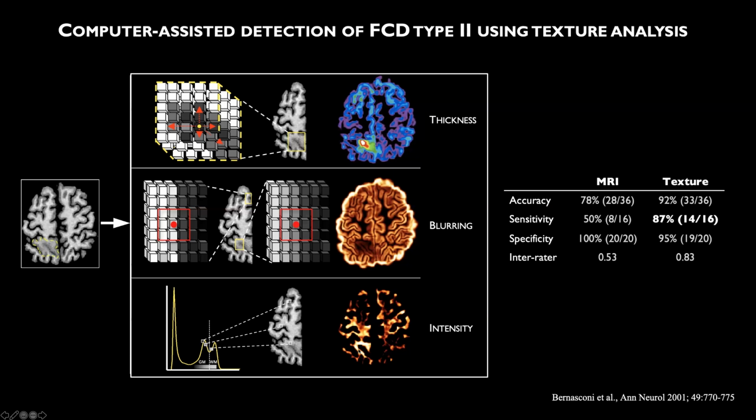Integrating this method in the visual inspection, we were able to increase our sensitivity by about 30%, from 50 to 87%, while maintaining more than 90% specificity.